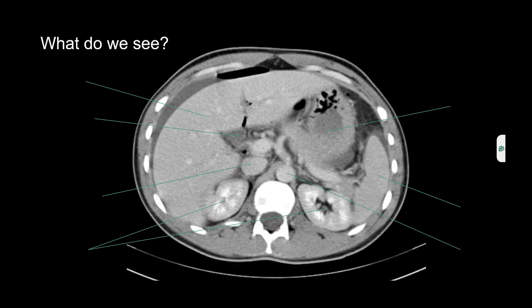So on the right side of our patient's body, from the top, we have the liver. And right below that, that smaller structure is going to be our gallbladder. This vascular structure in the middle, that's the inferior vena cava, or the IVC for short. And then at the bottom of our patient, near the spinal column, is going to be both of the kidneys.